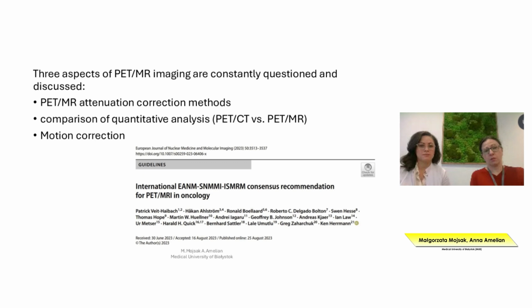And this is the recommendation of PET-MRI application in oncology. So these are the key applications that I discussed. So actually, PET-MR is not as good as PET-CT, but it seems that PET-MR is much better in providing the information for the treatment of patients suffering from these key application diseases.